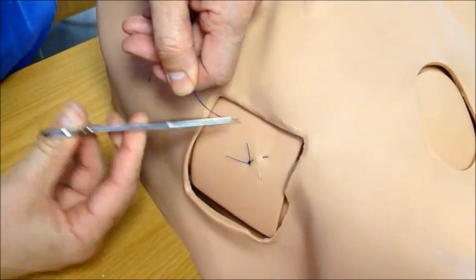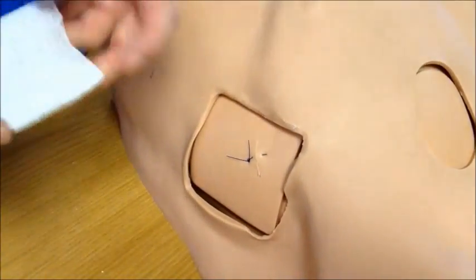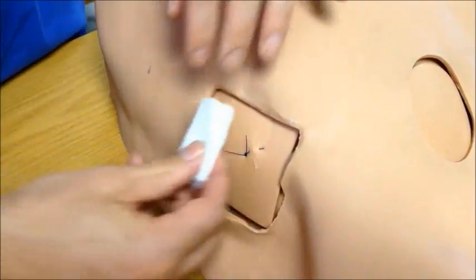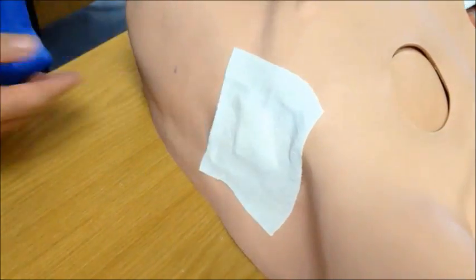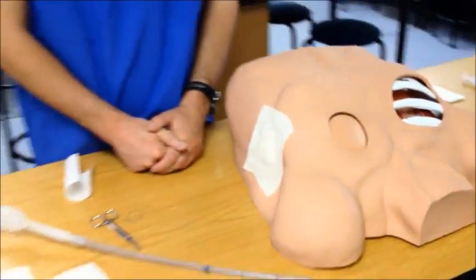Trim the edges neatly and dress the wound lightly. Instruct the patient to breathe normally and proceed with standard post chest drain removal care.